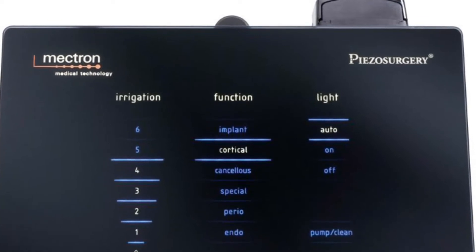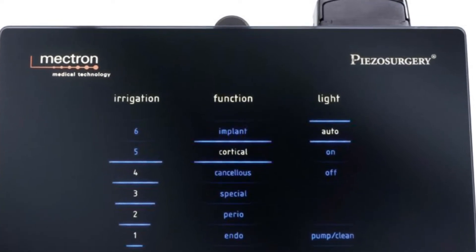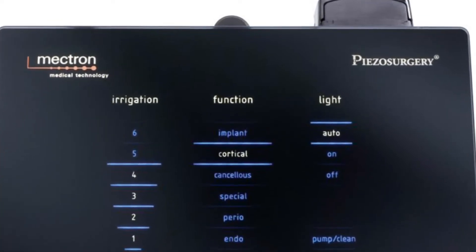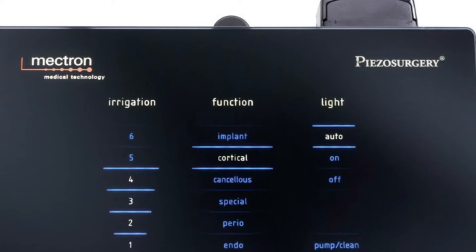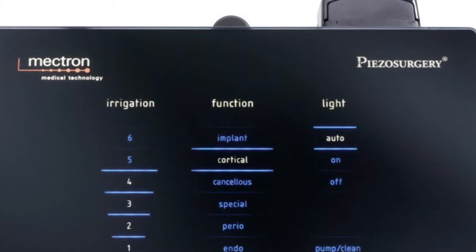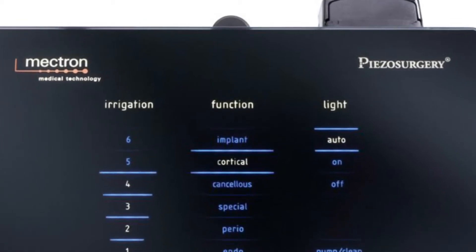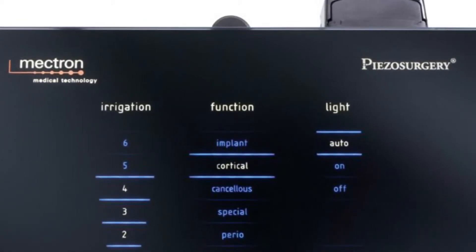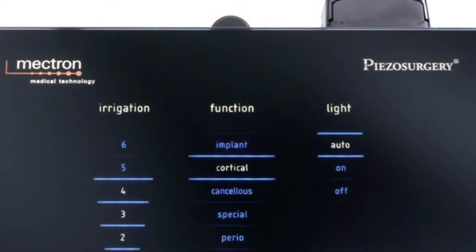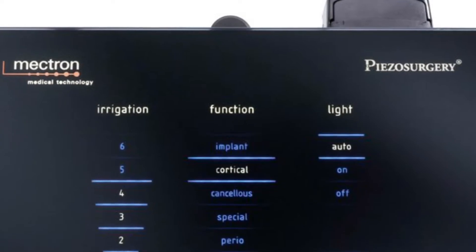Minimal heat is generated during the cutting, thus maintaining vitality of adjacent tissue. This procedure minimizes patient surgical trauma and promotes rapid healing.